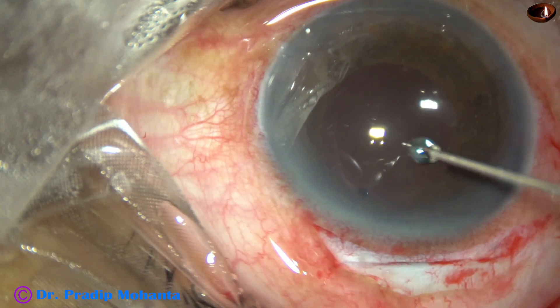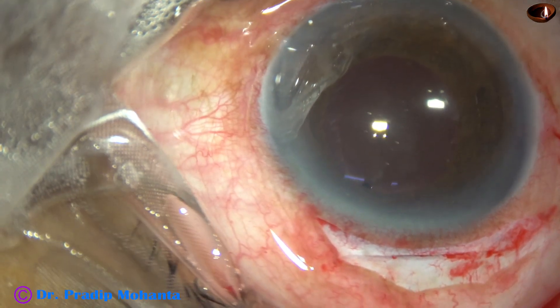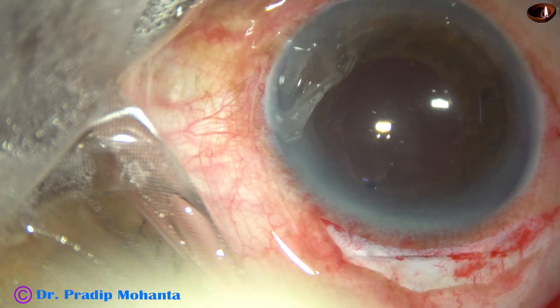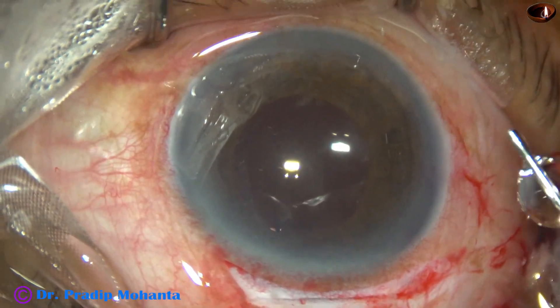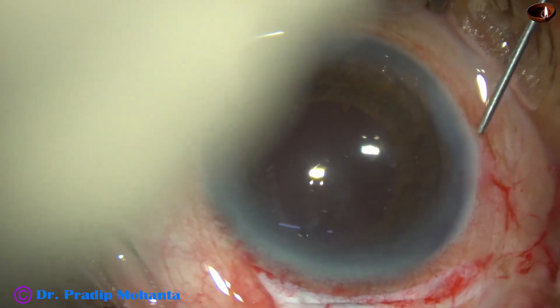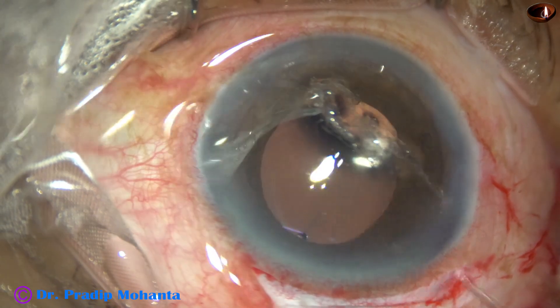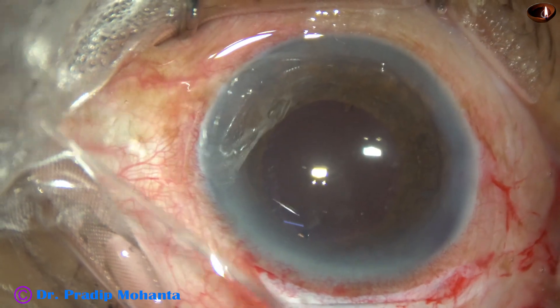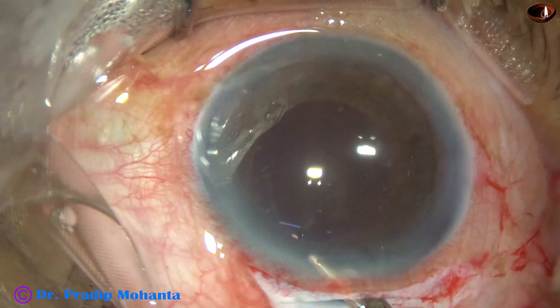We find there is no leakage from the main wound. A bit of moxifloxacin is applied. The side port is closed by hydrating the corneal stroma.